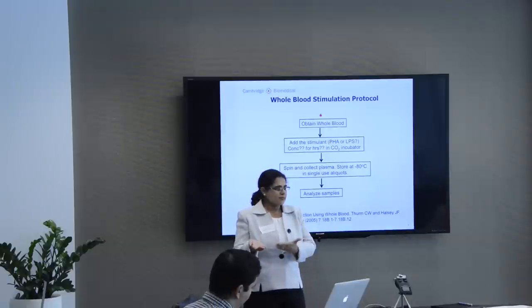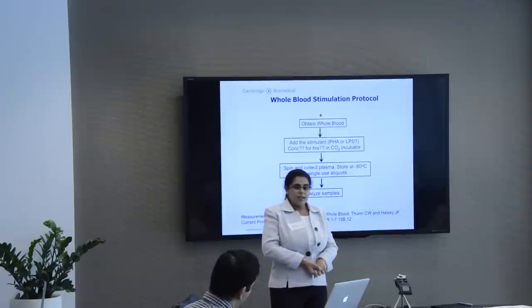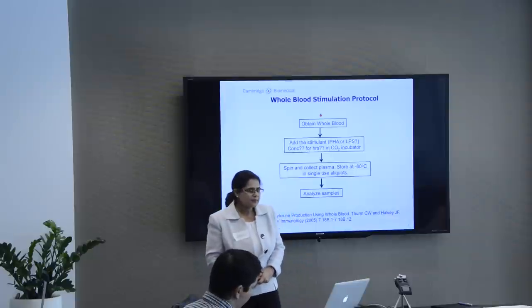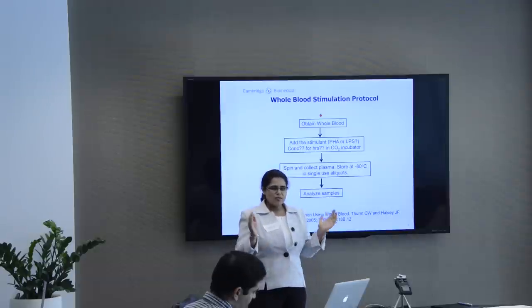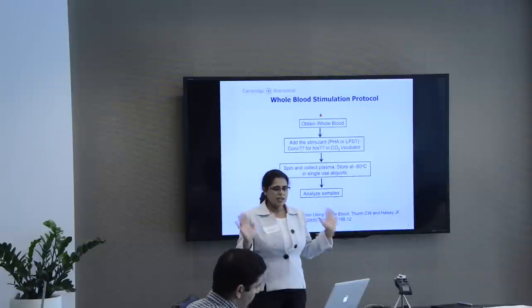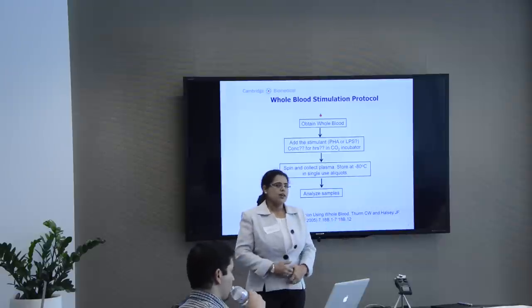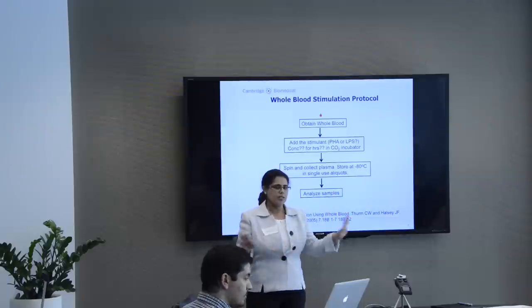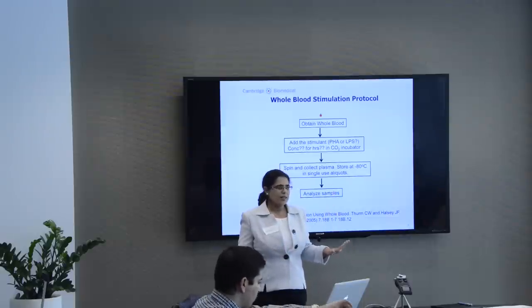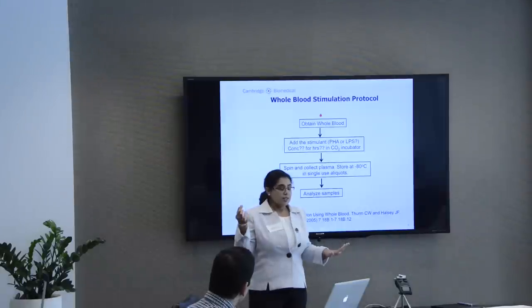So there's a problem. Your intra-assay is perfect. So why can't you just spike into the serum or plasma? For each assay, it's still a problem, because you take your serum samples, you take your recombinant cytokines, you spike them, and you freeze them down. You make one every quarter and you freeze them down. But what will happen is that when you do that, that sample goes through the freeze-thaw cycle, it loses activity. You don't get the same result.